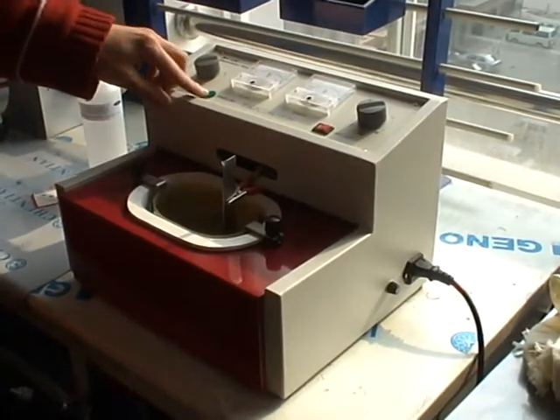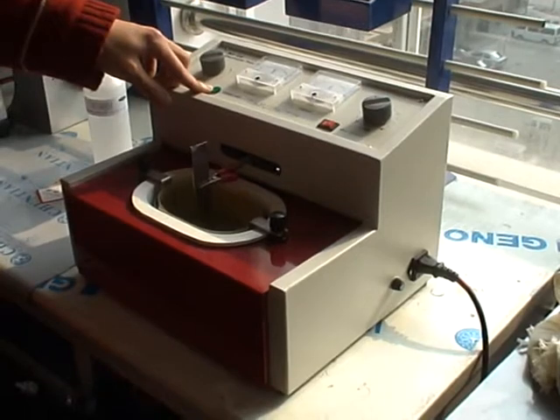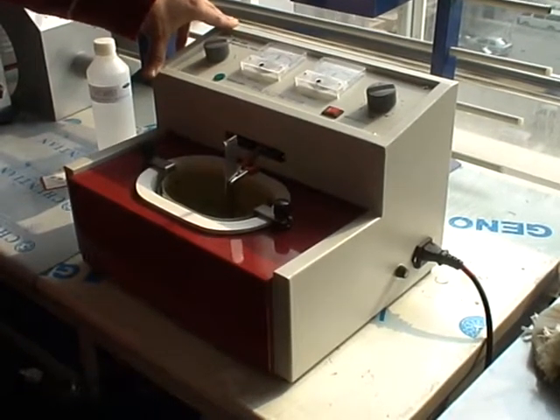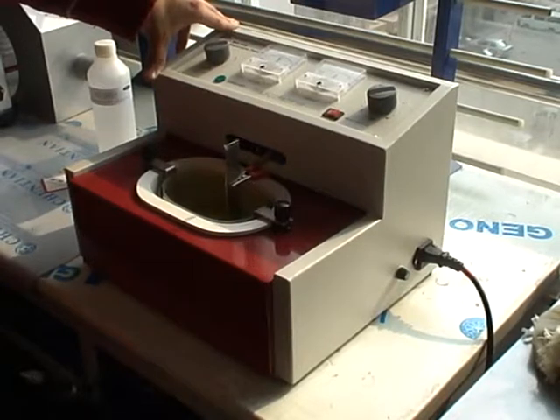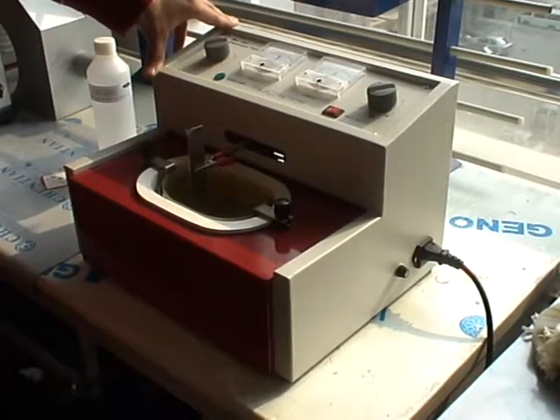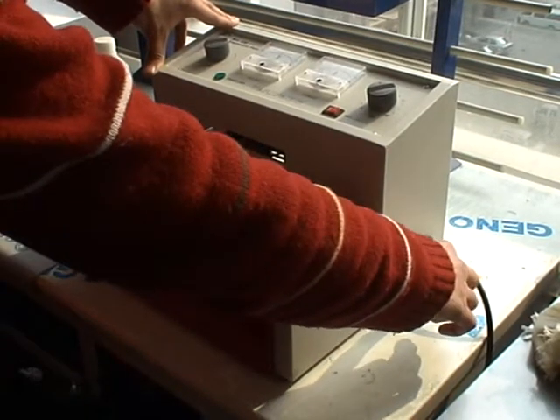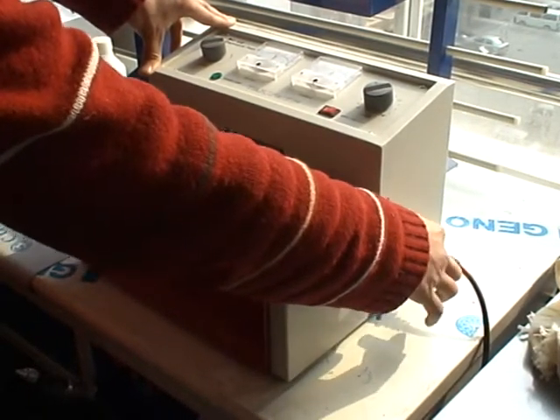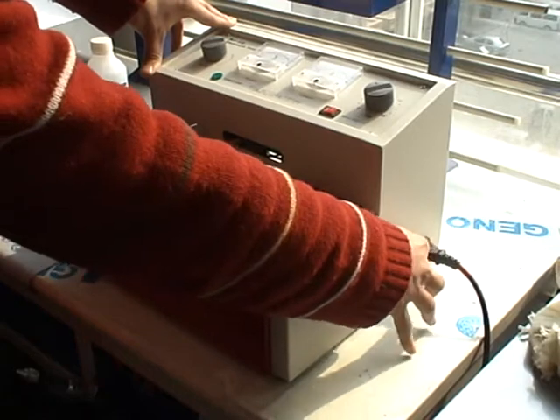Sometimes the power lamp is not on, which means that there is no voltage going through the machine. When this happens, you have to unplug the electrical cord and take the fuse tube inside the socket and change a new one.